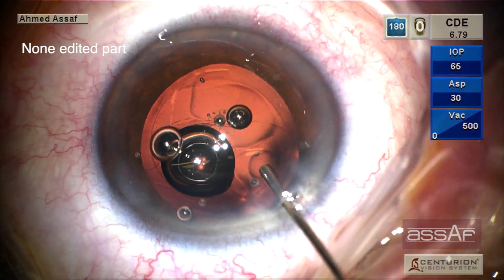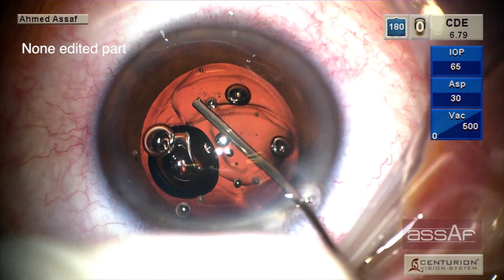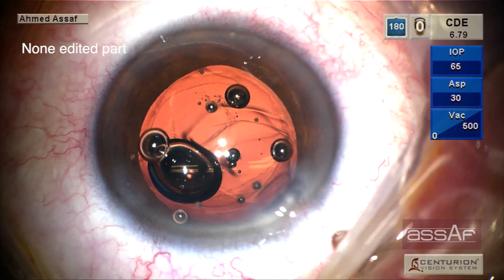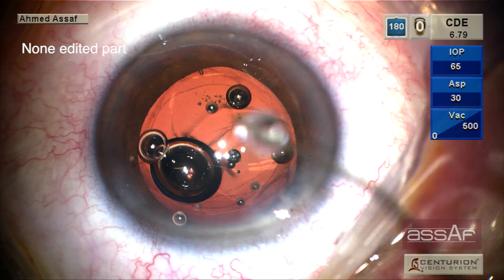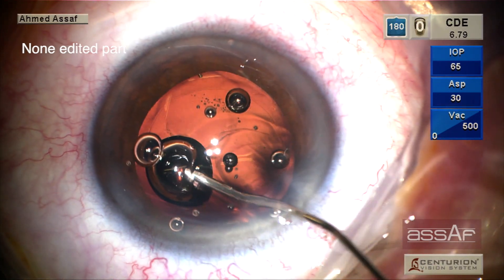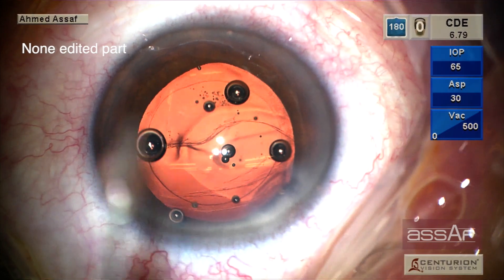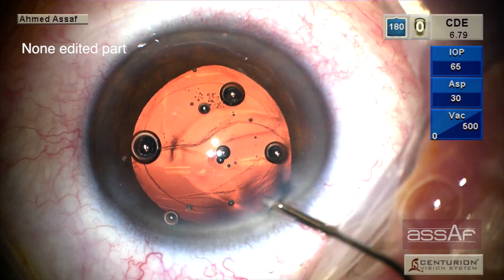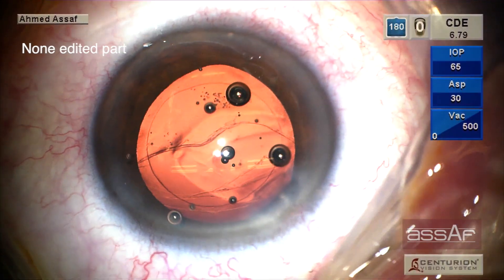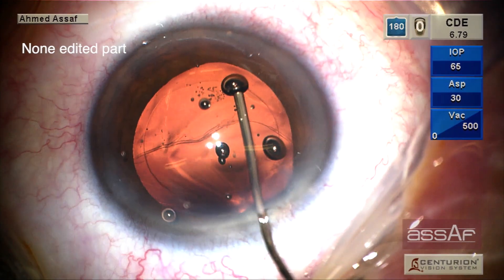Because of the rush, as you can see, the nurse didn't prime the dispersive OVD cannula before handing it to me. That's why we had some air bubbles inside the anterior chamber. It's not a big deal — we can just manually aspirate those air bubbles and continue management of this complicated case.